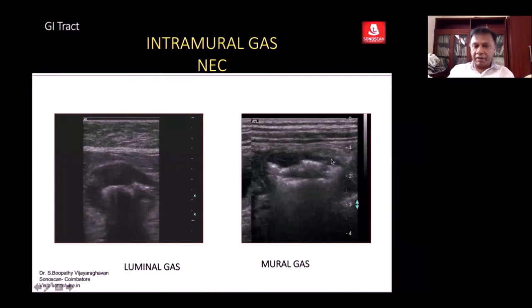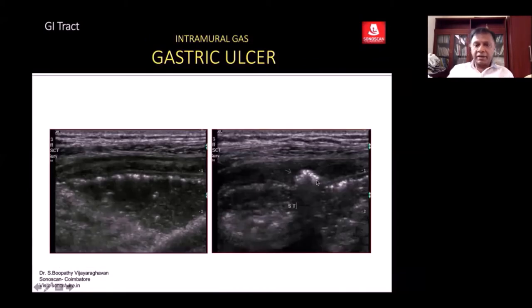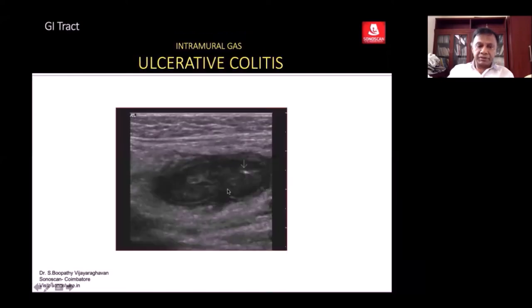You see gas within the wall of the bowel — to confirm it is in the wall, it appears like a circle. The bowel will be aperistaltic, and within the wall you see mural gas. You see a crater filled with air trapping outlined by gas. This is due to hypertrophic mucosa — within the mucosa you get air trapping due to ulcerations. That is the appearance of an ulcer.